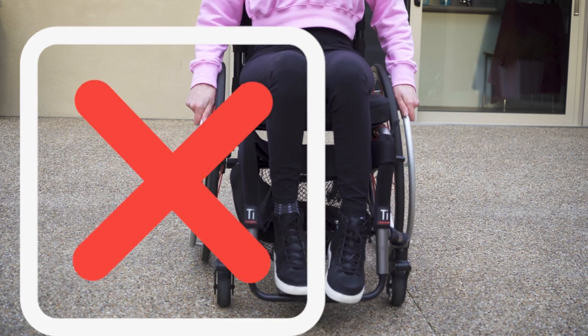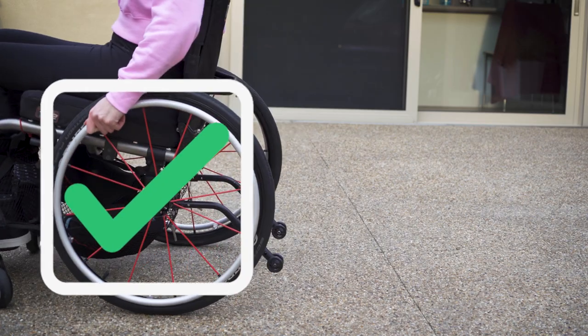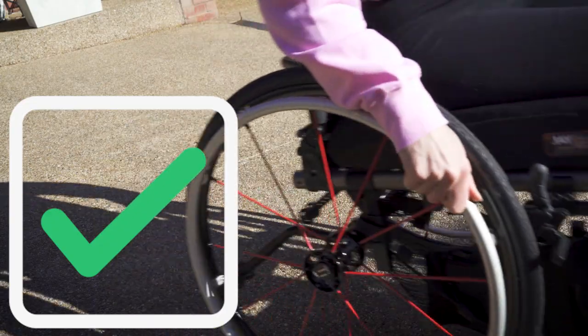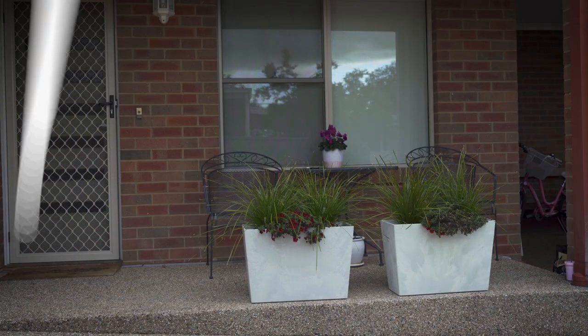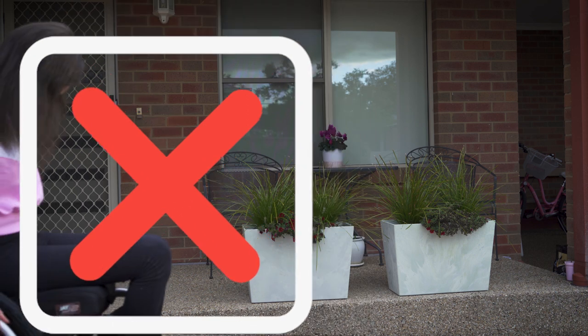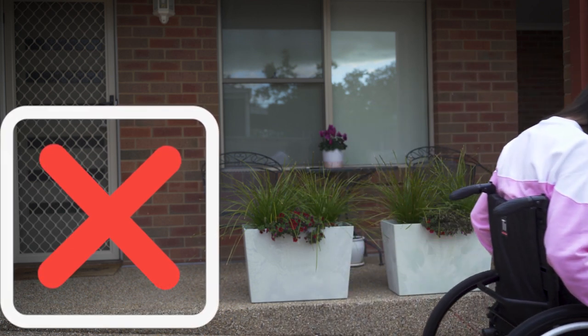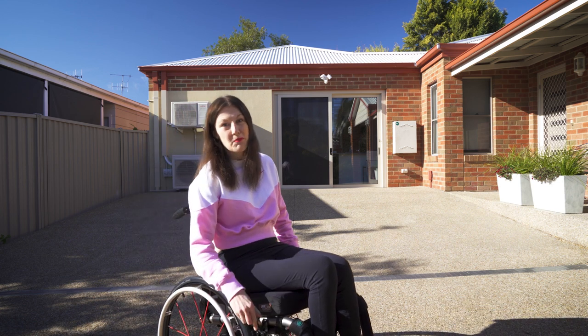If you suddenly stop, there is a risk you might fall forward. So to stop safely, what you should do is hold tightly on one side of the wheel — you will turn to the side — and then you can evaluate what to do next. It is also very important as you go down that you keep holding yourself back, because if you put your weight at the front of the chair, the wheelchair could potentially roll forward. Once you reach the bottom, you can stop and put your brakes on.